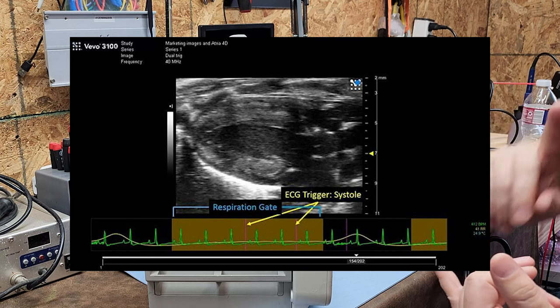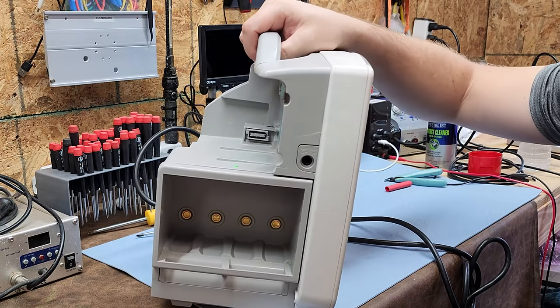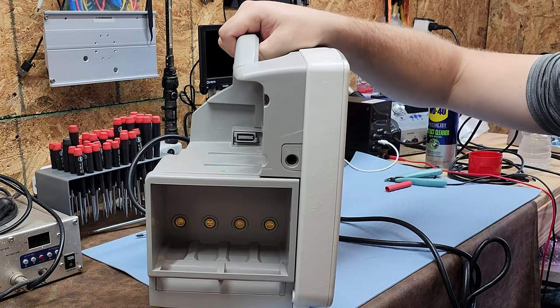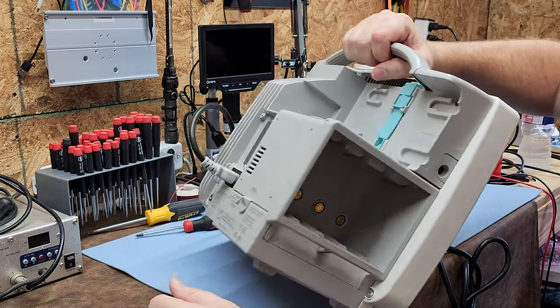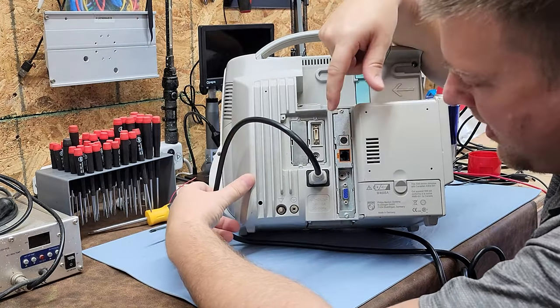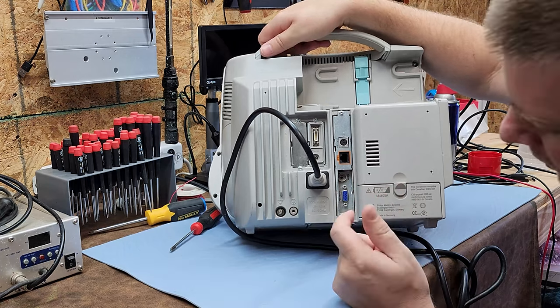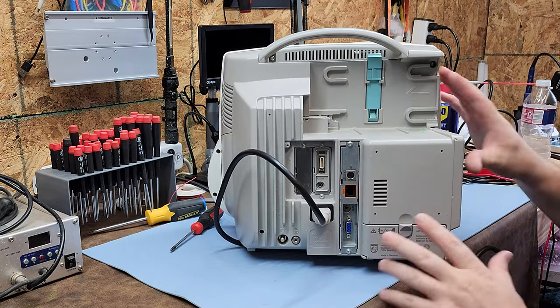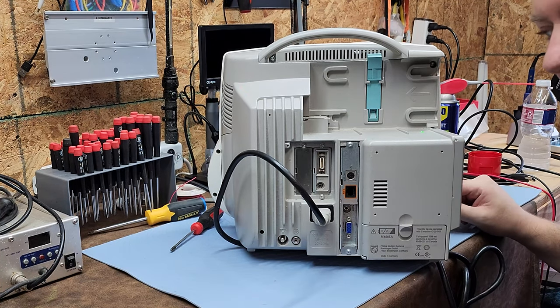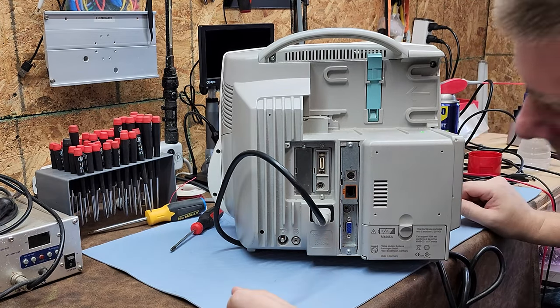On the back, right here is the interface port for the MMS module, and over here is an ECG out port. This port allows the ECG signal to go to an echo machine so it can take images at very particular points of the ECG QRS complex. It uses a double-ended mono phonograph cable that plugs in here. We use those quite often.